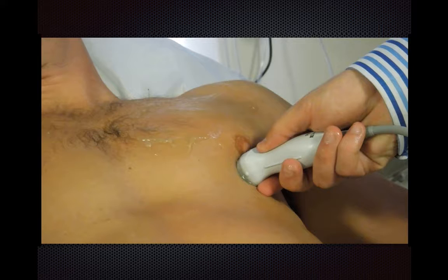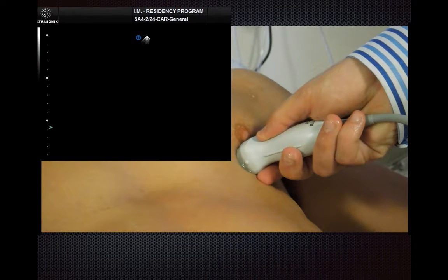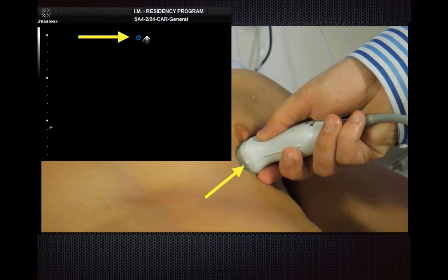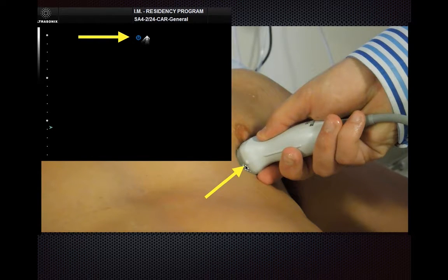In terms of where you point the transducer marker: if you're operating under the abdominal or emergency medicine setting with the screen marker on the left-hand side of the screen, then you're going to want to put the probe marker towards the patient's right. That would be the same as what you would do if you're doing a FAST exam — your screen marker is on the left-hand side and you generally point the transducer marker to the patient's right.